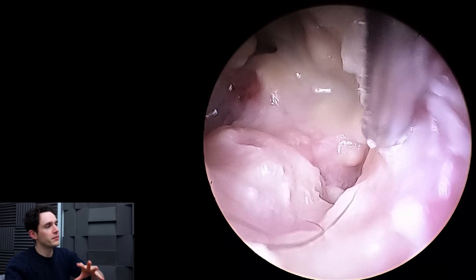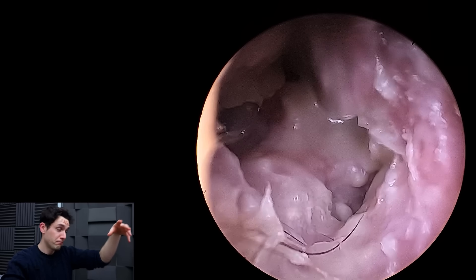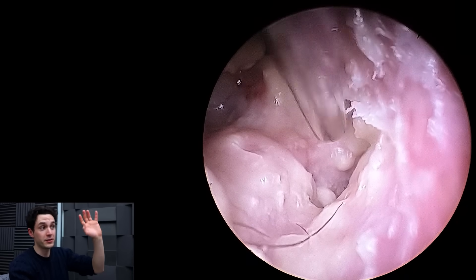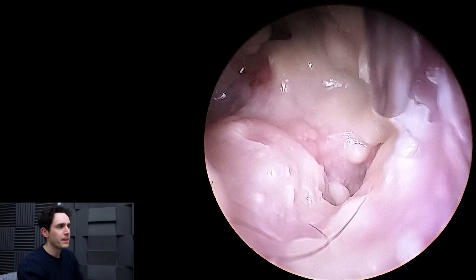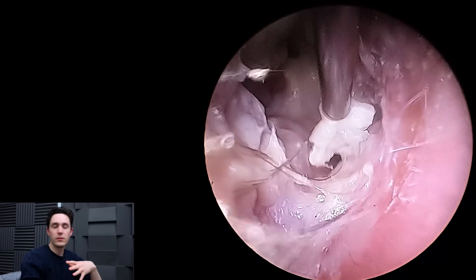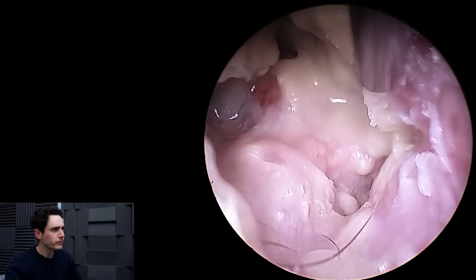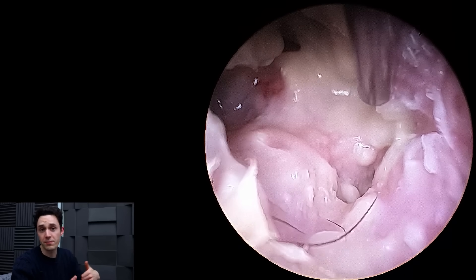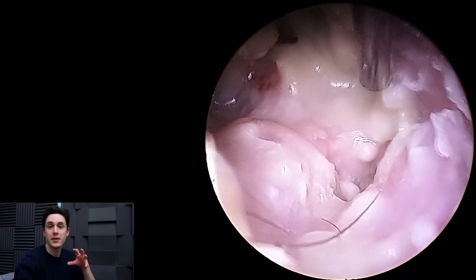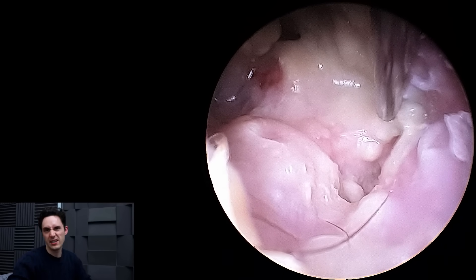I started the jargon by saying that it was an infected mastoid cavity, and you don't have to be an expert or a scientist or a doctor to work out that there's an infection here because of the amount of pus. Pus is a sign that the patient's immune system is responding to a pathogen. Basically, pus is lots and lots of dead white blood cells which die when they attack the bacteria, along with exudate and dead skin and so on.